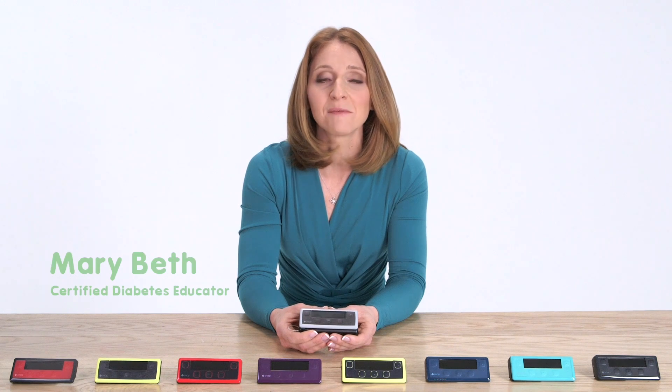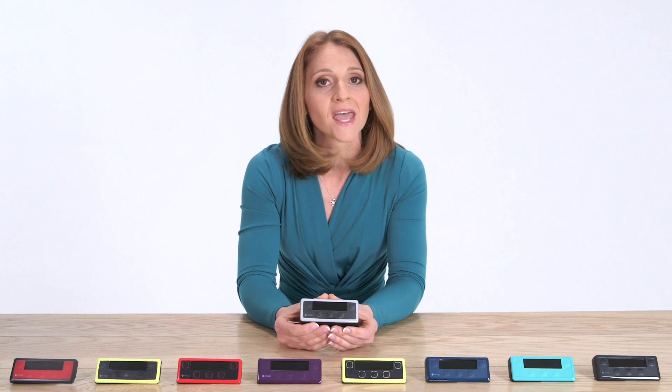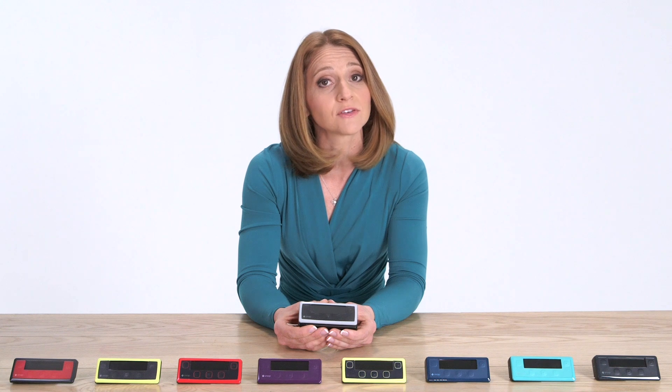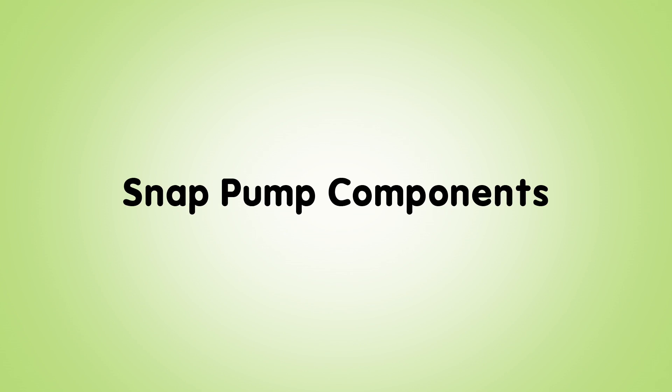Hi, I'm Marybeth. I'm a certified diabetes educator and this is a SNAP insulin pump. Today I'm going to talk with you about its revolutionary design and how its automatic features can give you less prep time and more lifetime. So let's get started.